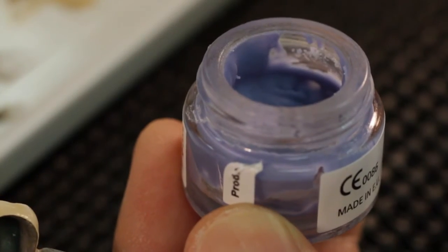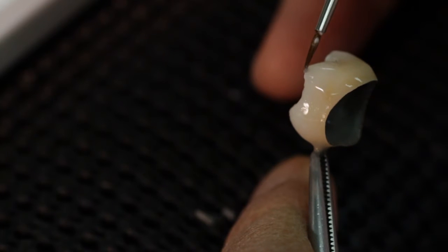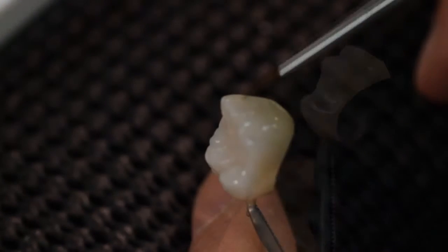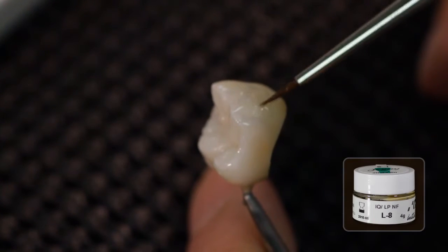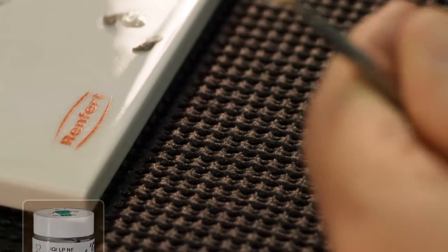Two bluish effect Lustre Paste NF — L5 light blue and L6 dark blue — provide a bluish opalescent appearance in the incisal area. Greenish effect Lustre Paste NF L8 olive, for a greenish effect, can be mixed with all Lustre Paste NF. In order to achieve an even higher transparency, the two grayish effect Lustre Paste NF L3 or L4 can be used as well.